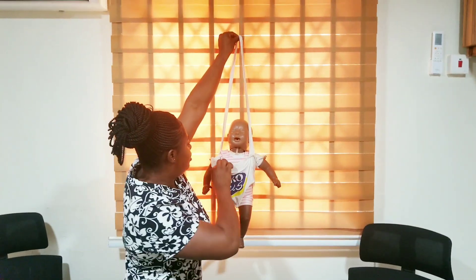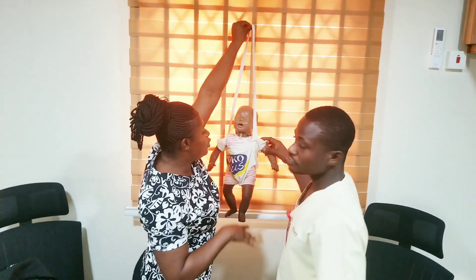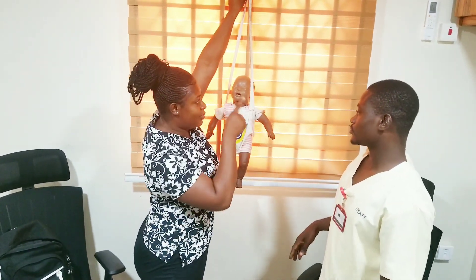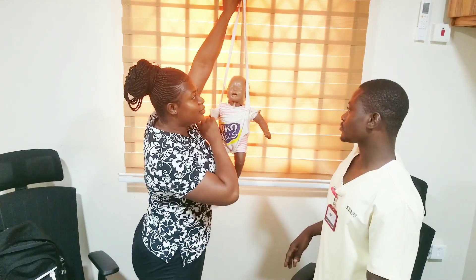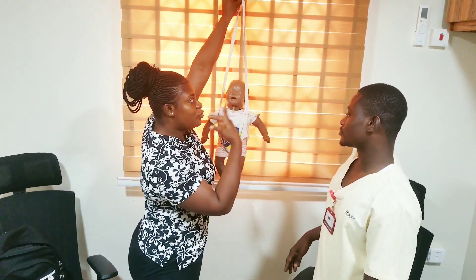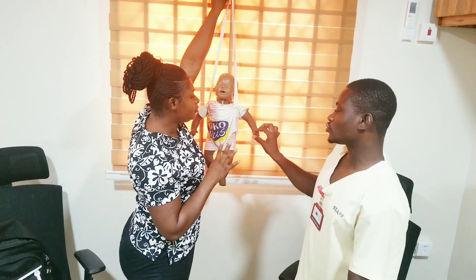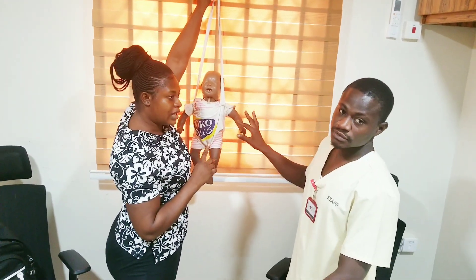When you hang the baby on the scale, you leave the baby and then take the weight reading from the scale. You have to read from eye level. The calibration should be on the zero mark before you begin, so that you can get an accurate reading.